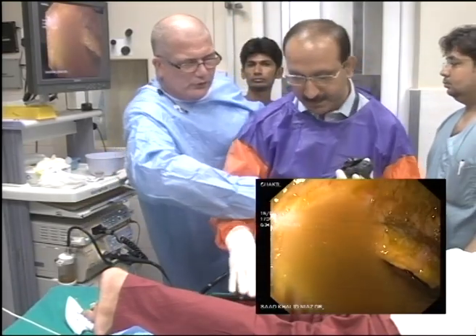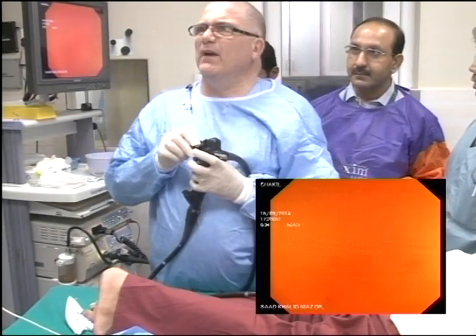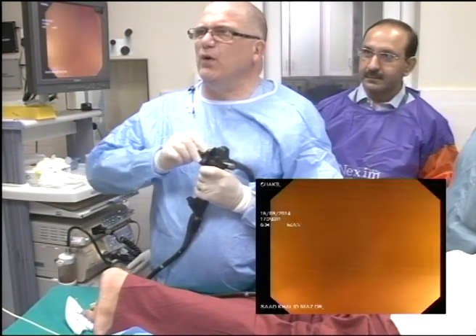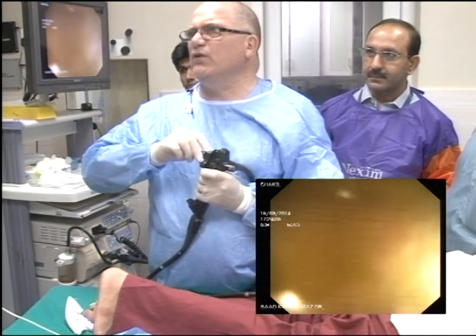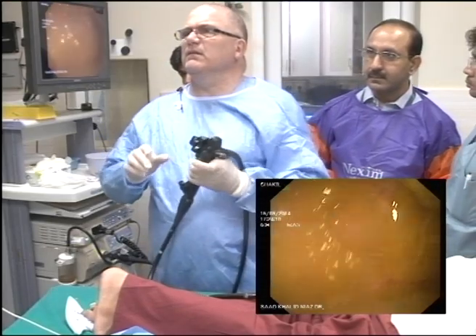Let me do this, my friend. I'll show you what to do. When you get poo onto the scope and you can't get it off, the trick is to put it right against the mucosal wall. Keep the water going, just against the mucosal wall, just for a second or so. There you go.